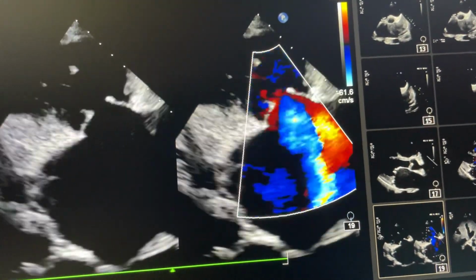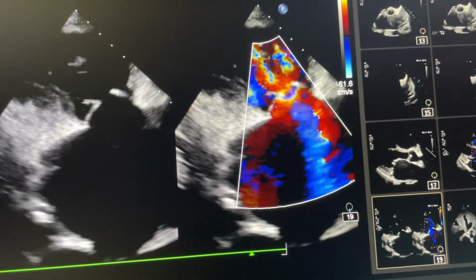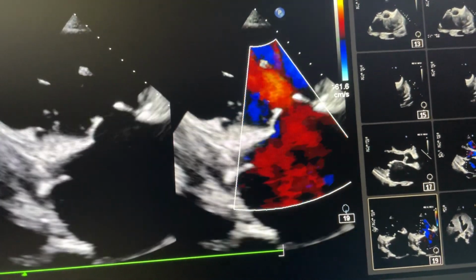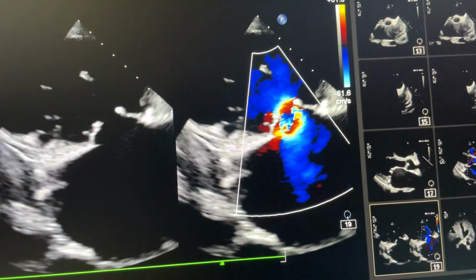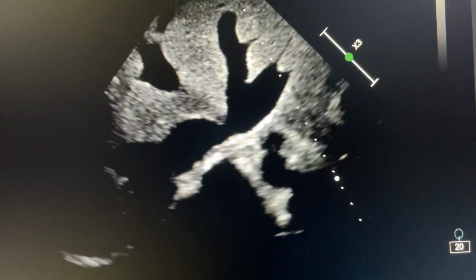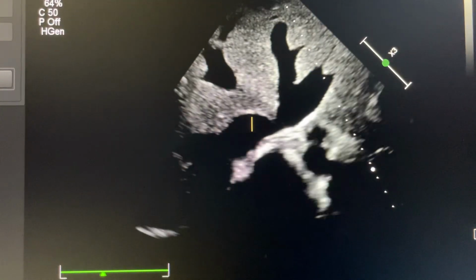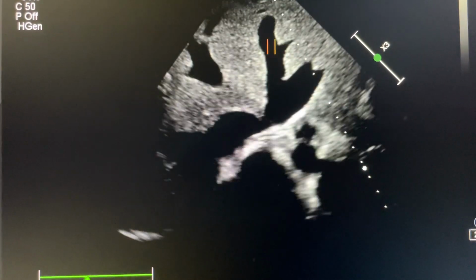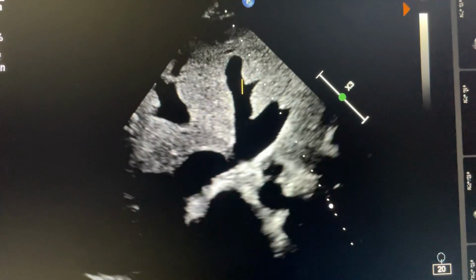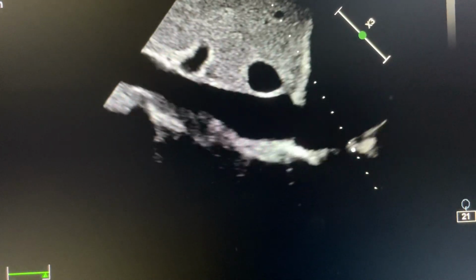So if you grade pulmonary artery hypertension by measuring the peak velocity across the tricuspid valve during systole, that is TR, that will not be very high. You see the IVC is quite dilated. Hepatic veins are also dilated. This is IVC. These are hepatic veins, dilated hepatic veins. You can see the IVC dilated.